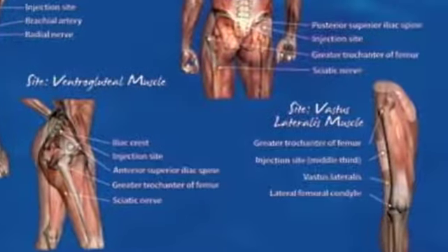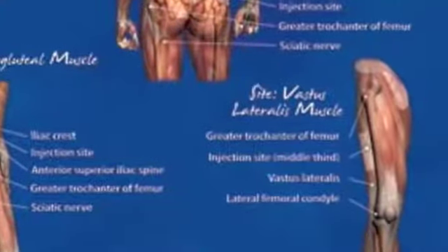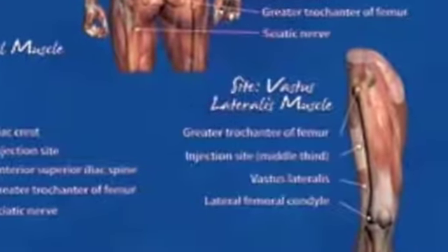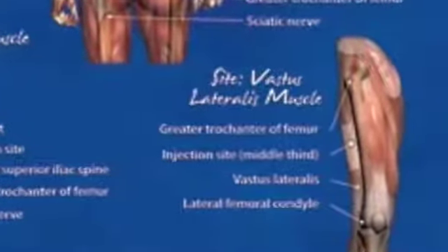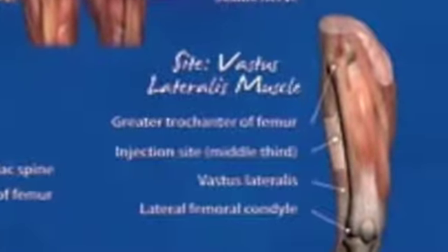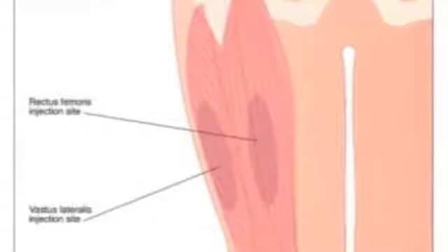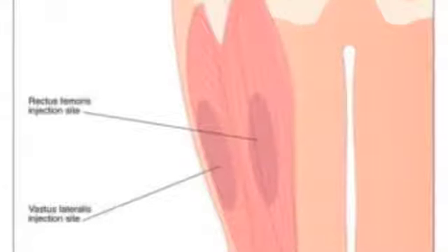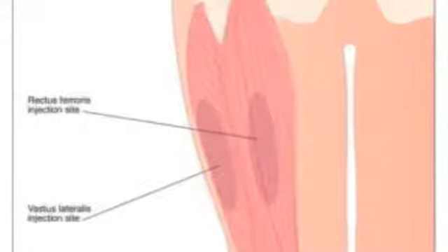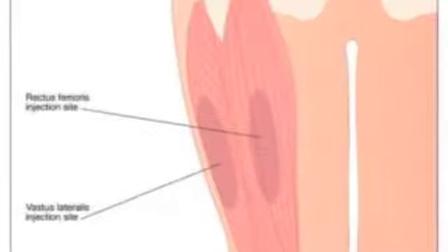Probably the easiest area to reach for self-administration of intramuscular injections is on the thigh, in the vastus lateralis or the rectus femoris. Although easy to access, I find it the most painful. Here is a schematic of the 2 possible injection sites on the front of the thigh. Here we are looking at the right thigh of a patient. The shaded areas are the appropriate sites for injection.